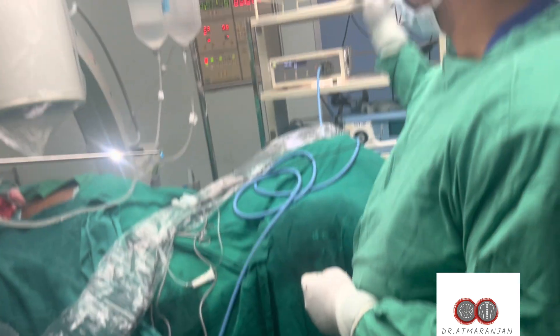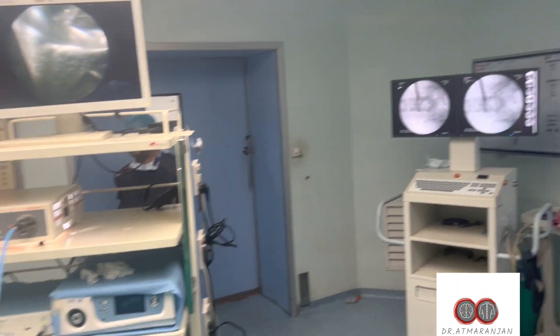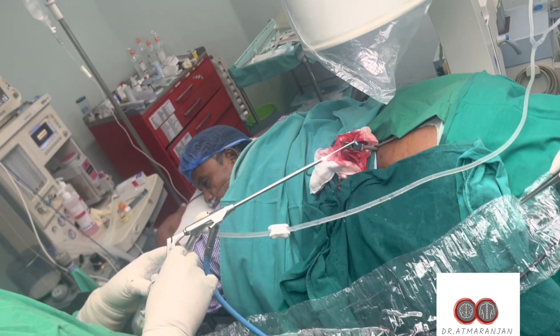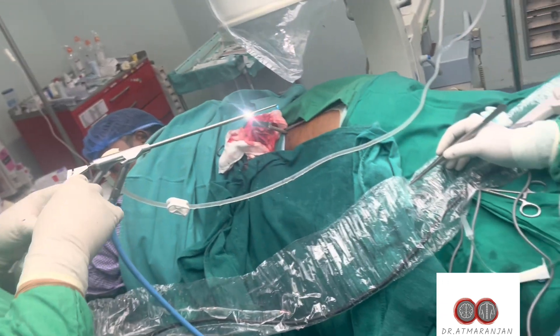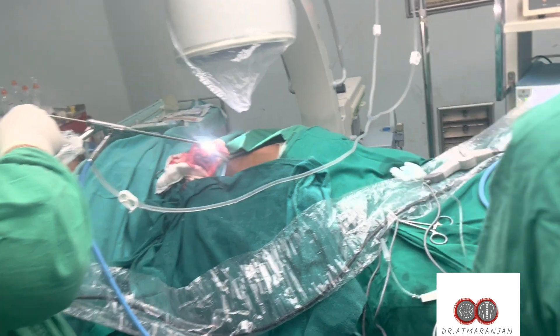There is a scope going in, and you can see this patient is awake as I am placing the scope — he is nodding his head. We are taking real-time inputs about his pain, his motor functions, and his leg movements. The disc fragments are carefully being removed.